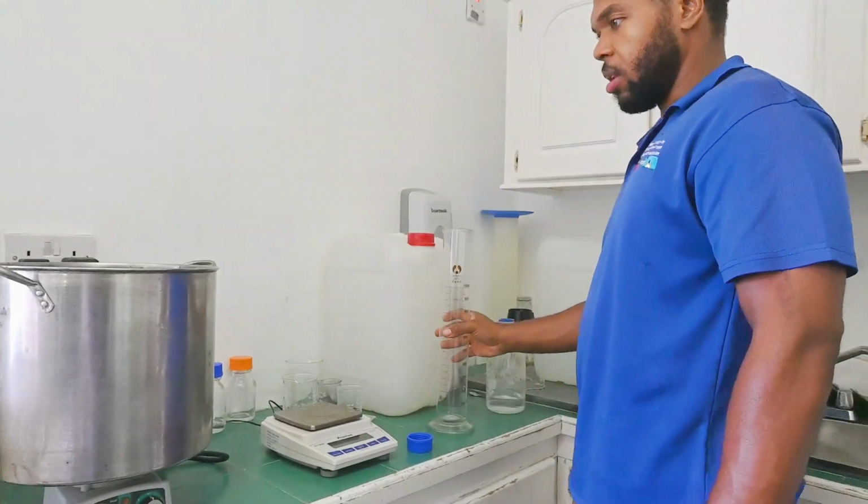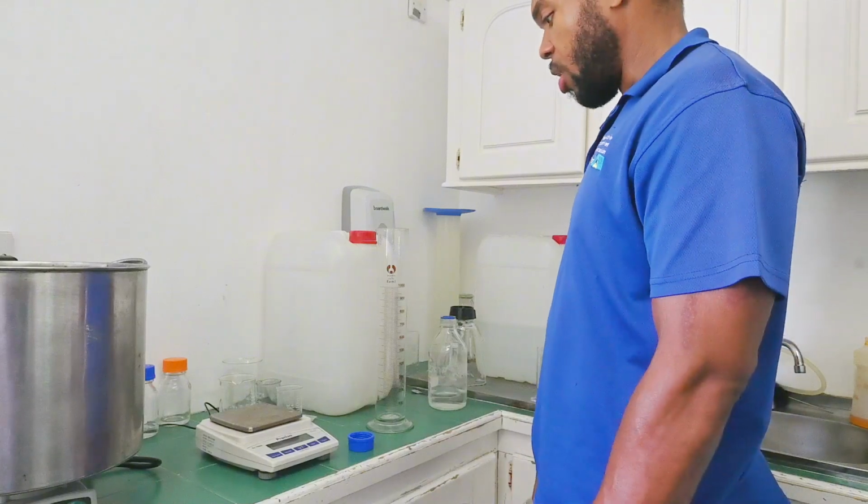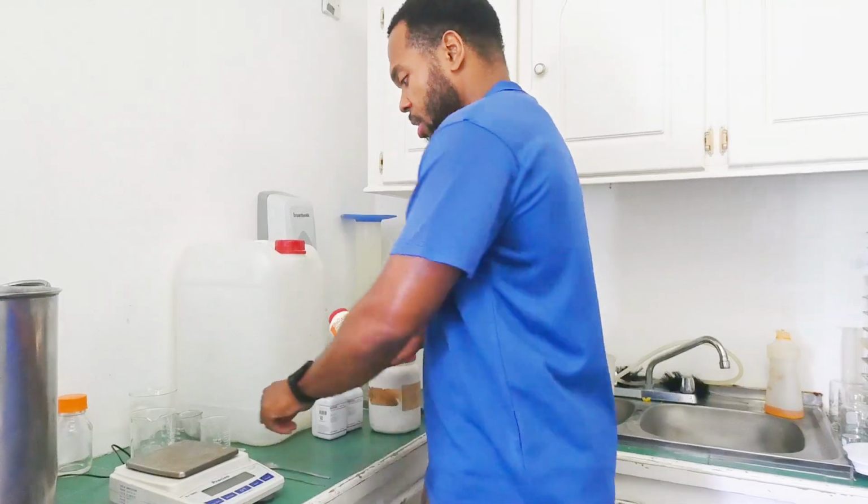So we finished adding all the liquid stock solutions. Next we're going to add the dry material that we're going to measure on the scale. We're going to add the dry ingredients now.